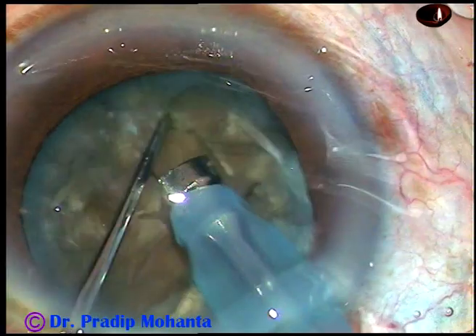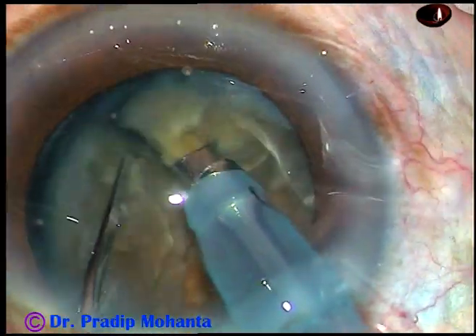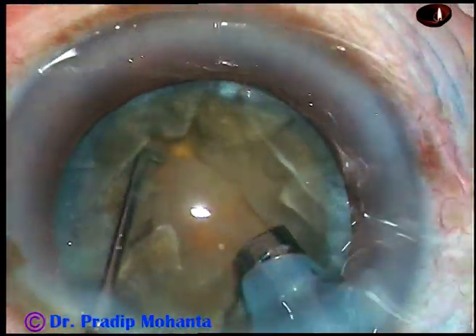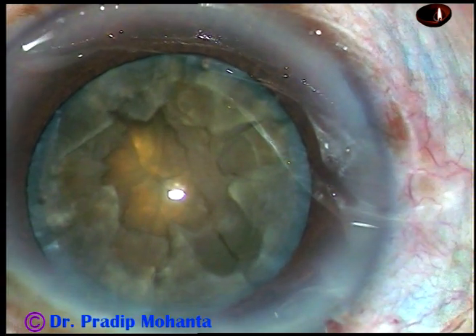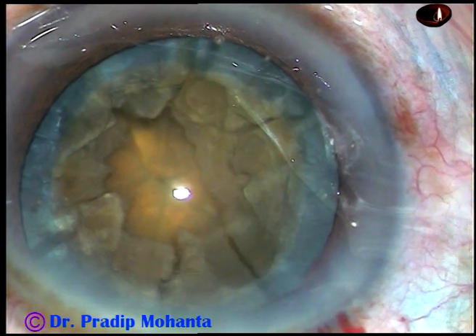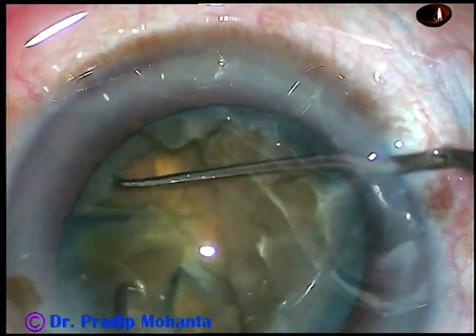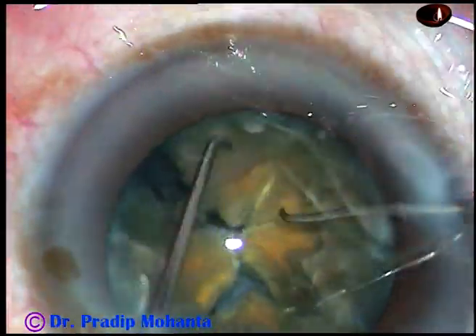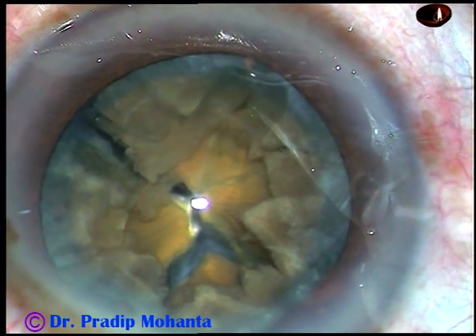And now I am trying to chop each hemi-nucleus into three pieces. But the leathery posterior plate did put a lot of resistance and I could not separate the pieces freely. So, I sculpt a little more, come out, inject some viscoelastic substance, and try to separate the fragments manually. Yes, with the help of the chopper and the Sinskey hook, the fragments have been separated nicely and we have five free fragments in this case.